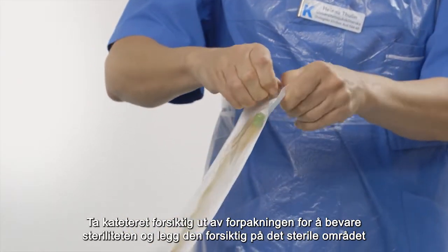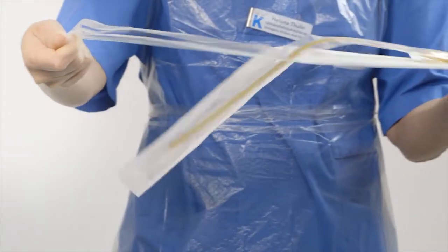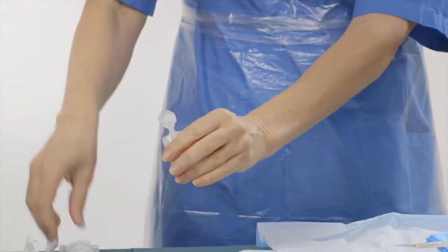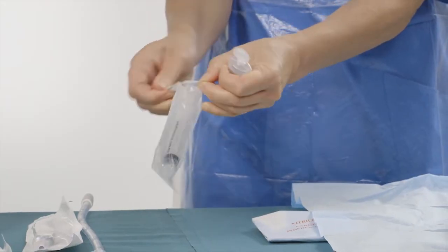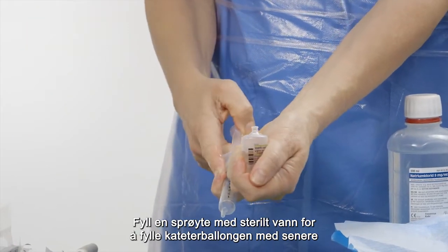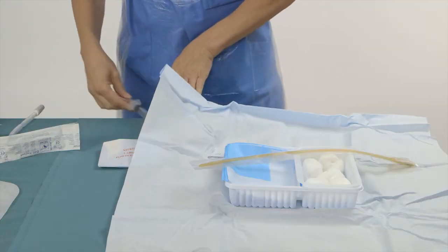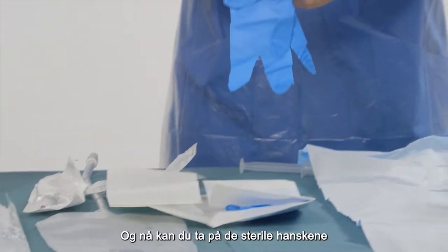Remove the catheter from its packaging while carefully keeping its sterility and place it on the sterile field. Fill a syringe with sterile water that you will use to fill the catheter balloon with at a later stage. Only now put on the sterile gloves.